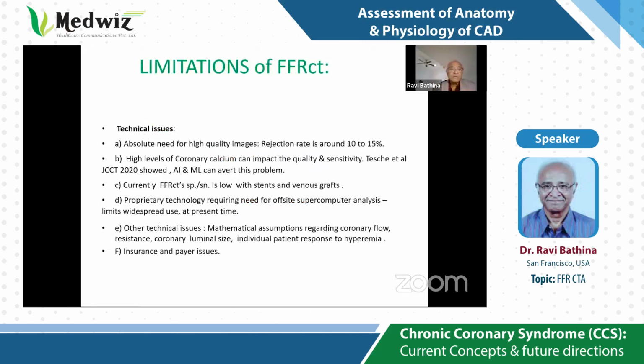Now, there are certain limitations, technical issues. For example, unless the CT we have done in the lab is perfect, high quality, without any artifacts, there is a high rejection rate, around 10 to 15%. Then, a high level of coronary calcium also impacts the quality and sensitivity of the findings.